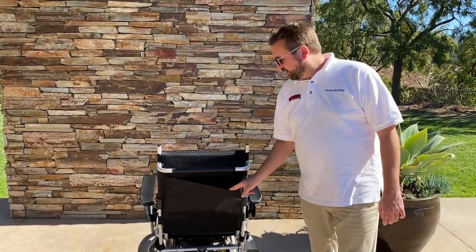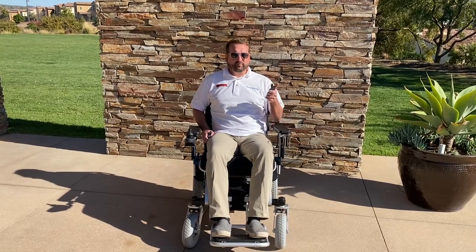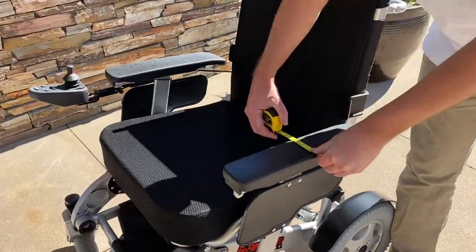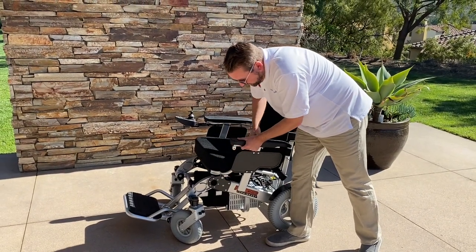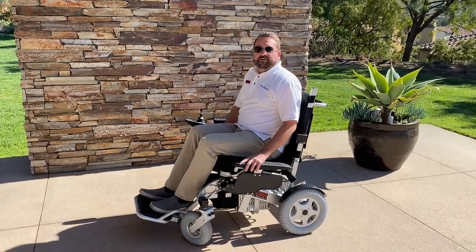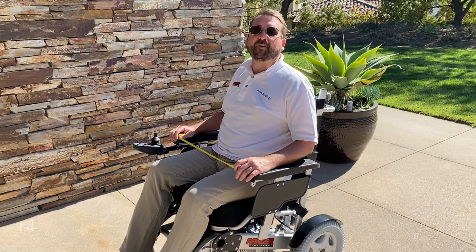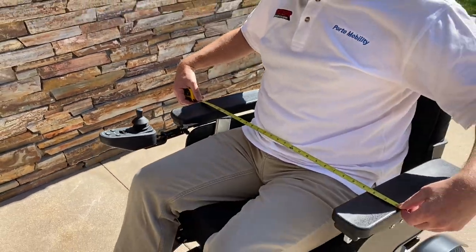It's got a backrest pouch for storage and a foldable push handle. The chair also comes with a seatbelt for extra safety — simply insert until it clicks. The armrests are three inches wide and are also adjustable. Lift the latch and adjust to your comfort level. You can put the armrest all the way down to enter or exit the chair, then press the black latch to lock it in place. The Beast offers a wide and spacious seat — 21 inches on the inside from armrest to armrest, and 27 inches overall.